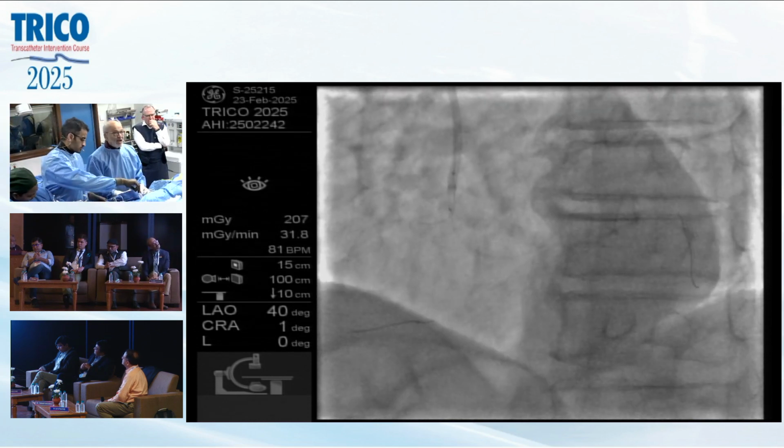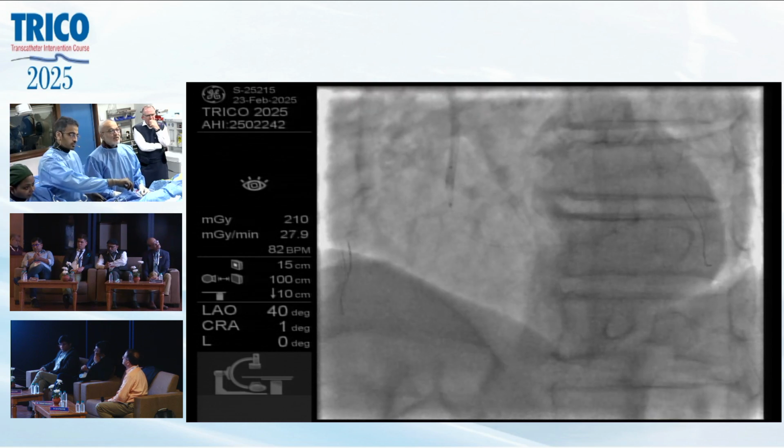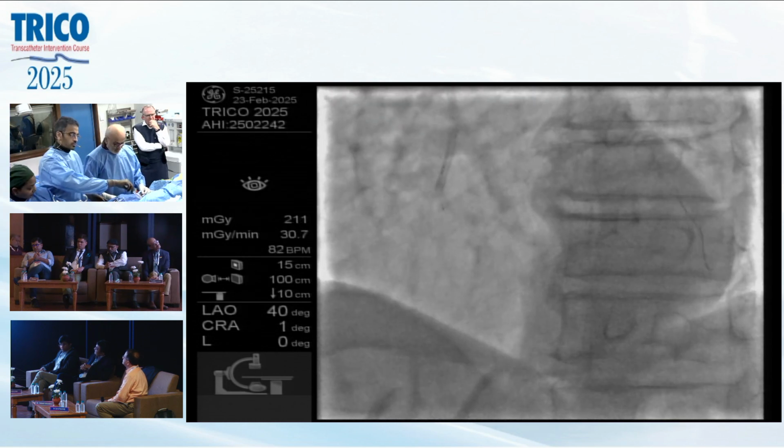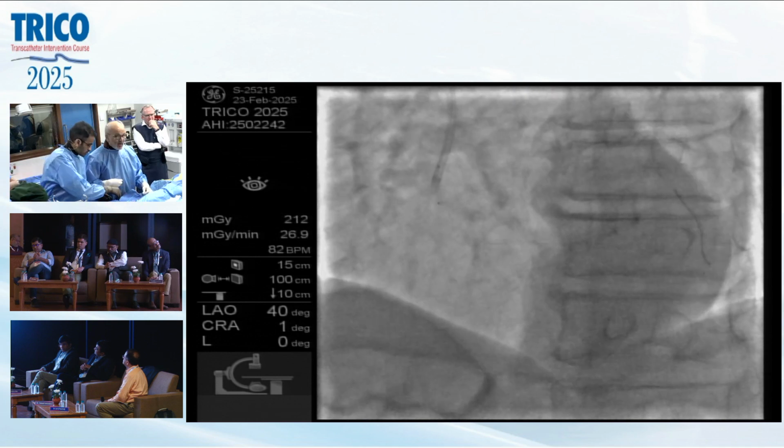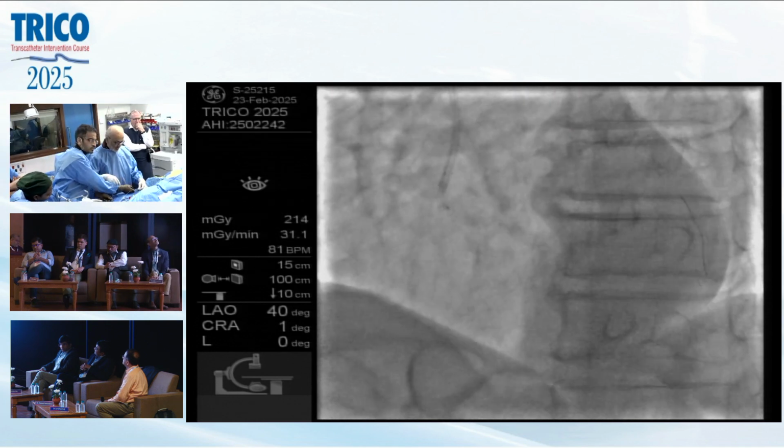Now I am going to remove the RCA wire very carefully. And I have a balloon access there. Just remove it. Remove it out.